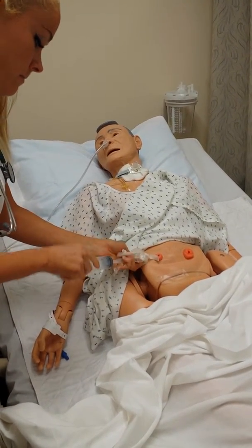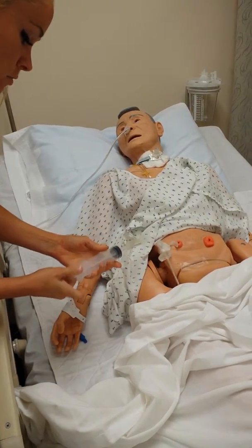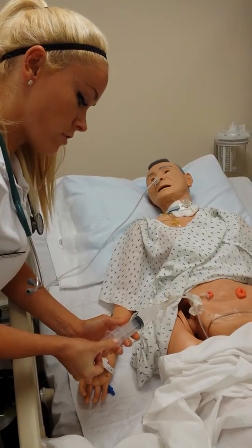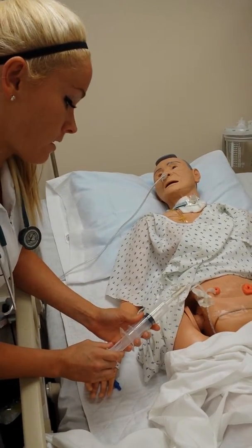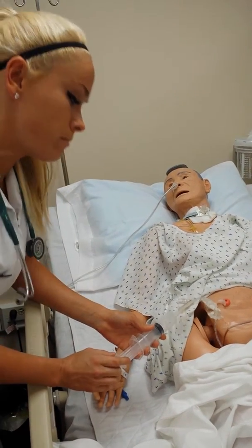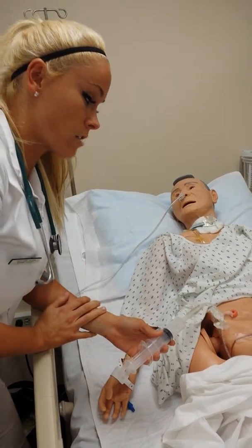We're going to check for any residual. You're going to clamp it open, connect this, and pull back for residual. Anything under 100cc you're going to push back; over 100cc you discard and notify the doctor. You also want to look at the color and consistency of the residual.